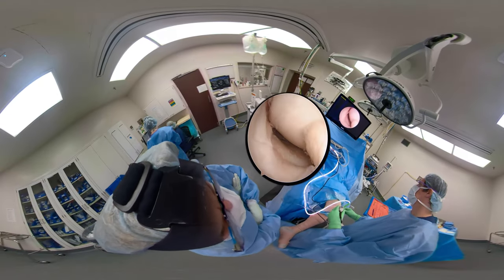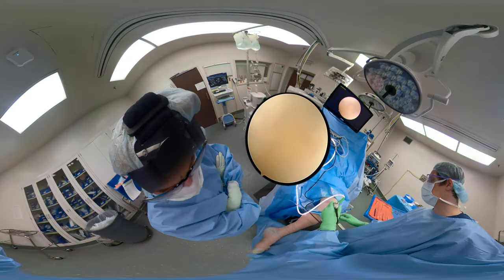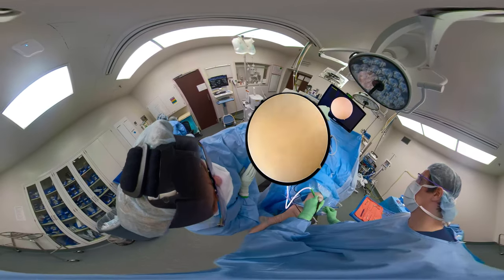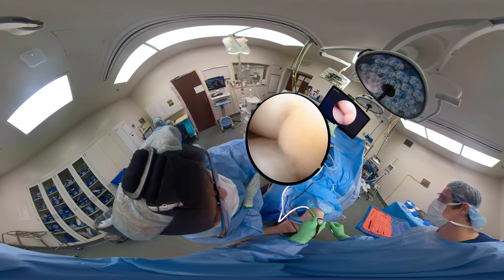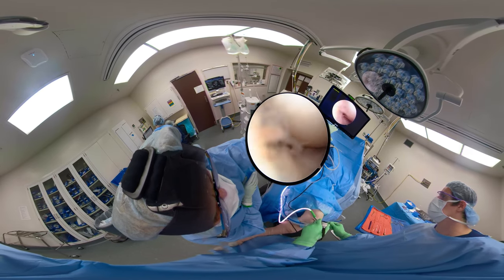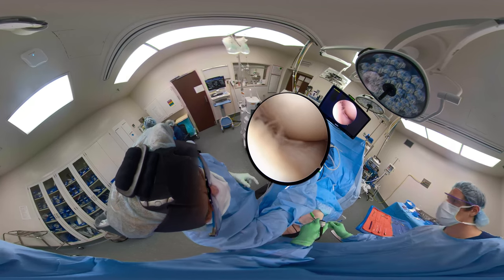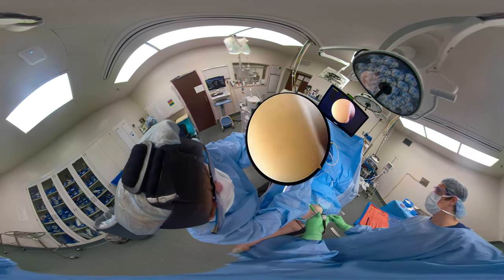Now we have the scope still medial. We're going to probe the lateral side. Got the fat pad in your face, and he drives posterior to the fat pad, and you can see the lateral meniscus that has a part that looks ligamentous. Oftentimes by MRI scan, there'll be a read of anterior horn lateral meniscus tear, which is usually not the case.